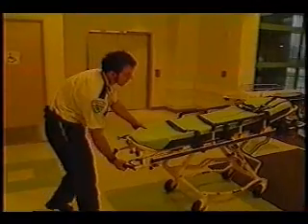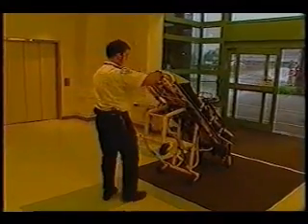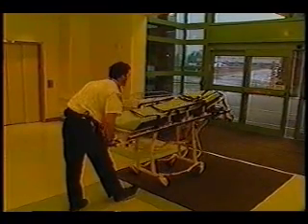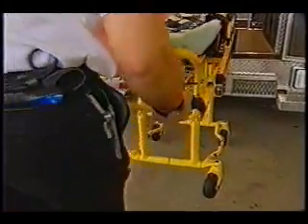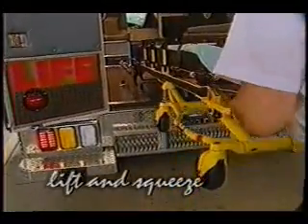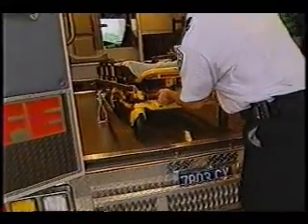One person can raise an unoccupied cot to loading position by tipping it onto its load wheels. Lift the frame slightly, squeeze the height adjustment release handle completely, and raise the cot to the desired position. To load the empty cot, as always, approach the back of the ambulance squarely. Again, since you're in the highest or loading position, release the auxiliary lock, lift the cot, and squeeze the height adjustment release handle completely as you push the cot into the ambulance. Then just secure the cot in the fastener.